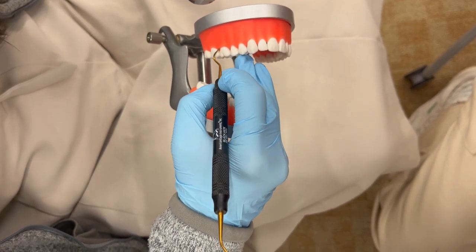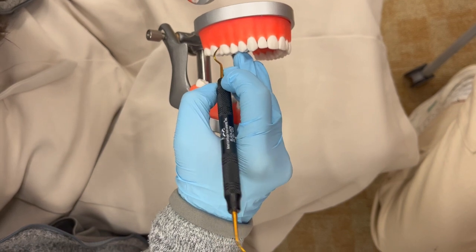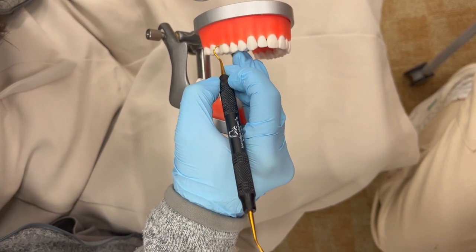For method 2, it's inner and outer cutting edges. So you want to hold the instrument so that you're looking down at the face. You want to determine which cutting edge is closer to the handle.